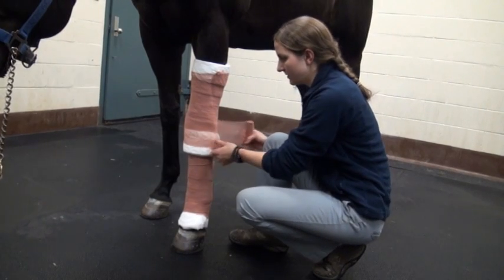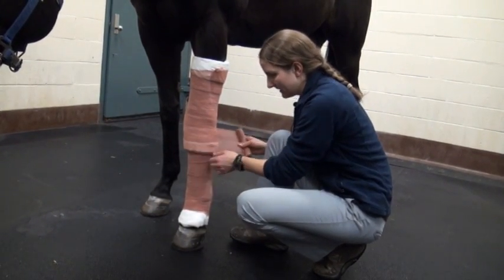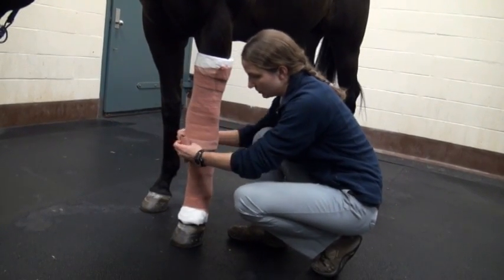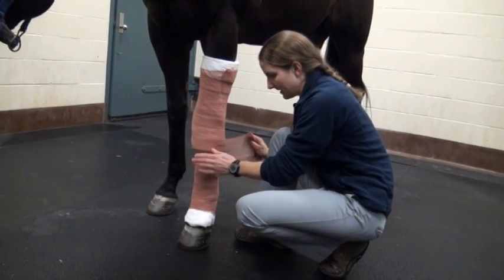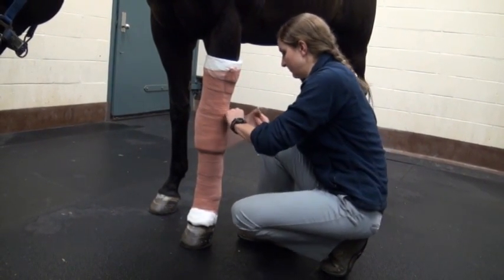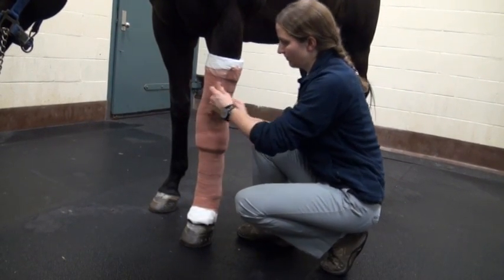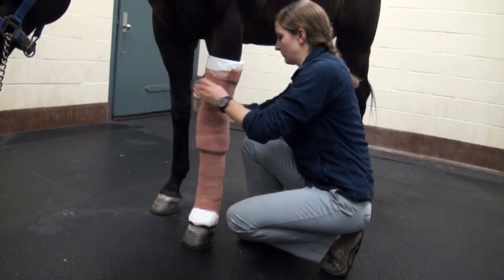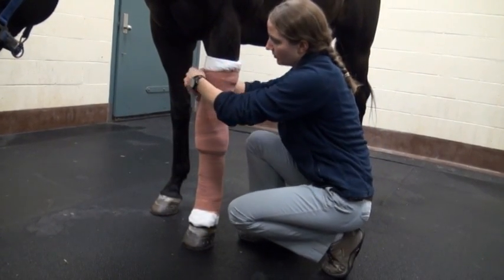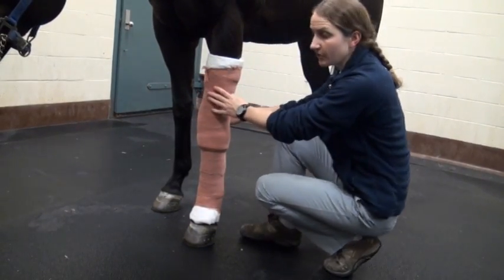With this brown gauze, it can be carried all the way down to the bottom of the sheet cotton and a little past it in order to really combine the top and bottom portions of the bandage. Once you've gotten down past that layer, you want to work your way back up. The tail of your gauze can again be tucked in order to hold it in place while you get ready to apply your next layer.